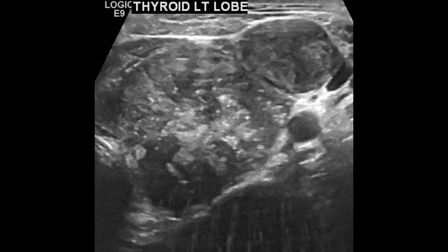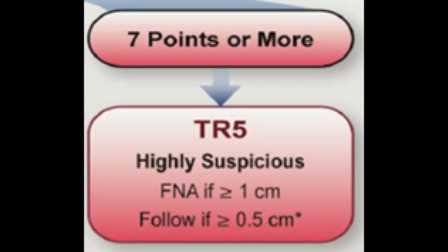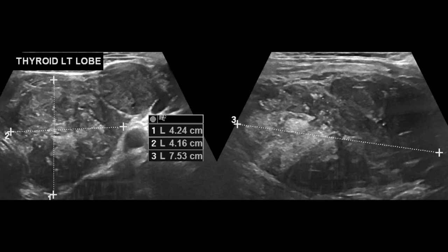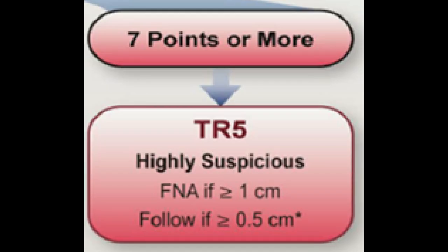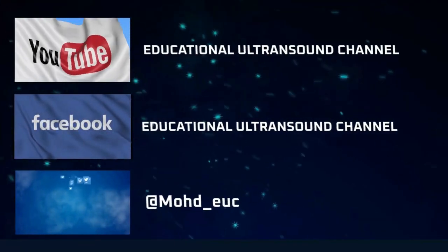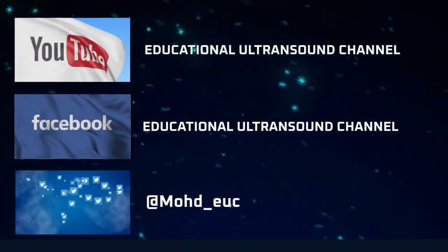The nodule also has macrocalcification with acoustic shadowing, so we give it one additional point. The total for echogenic foci is four points. Adding all points together gives us a score greater than seven, corresponding to TI-RADS 5. Since the maximum diameter is 7.5 cm, which is greater than one centimeter, this nodule is indicated for FNA. This is a highly suspicious nodule corresponding to TI-RADS 5.